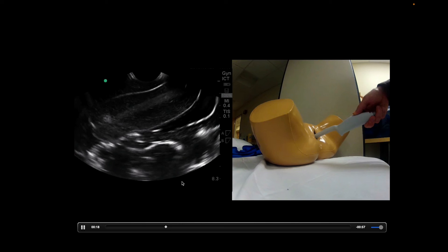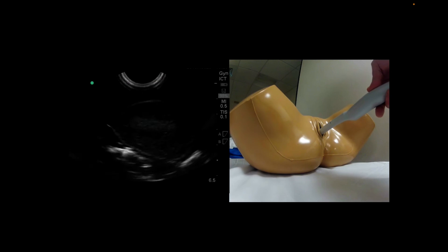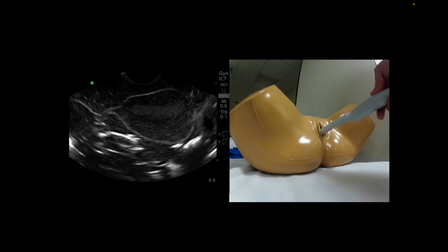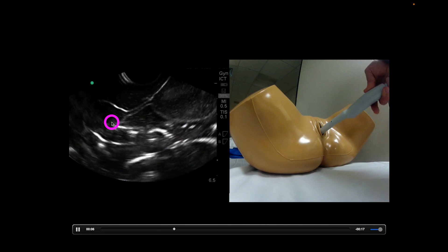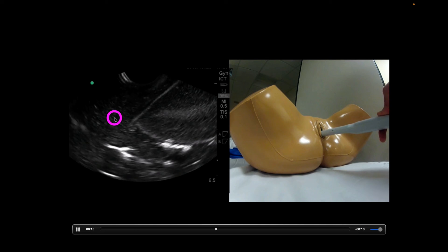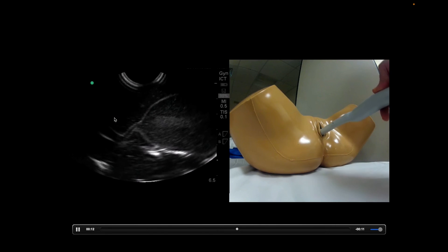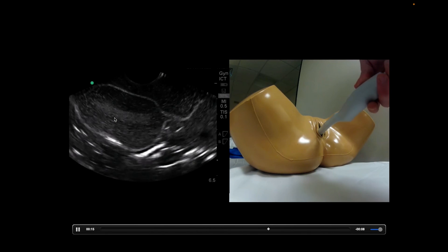Once you're done with the sagittal view, go ahead and change the transducer with the probe marker over towards the patient's right. Do the same thing — fan through making sure that you go left to right. We can see the adnexa over here, as well as up and down anterior and posterior, making sure to evaluate all of the structures that you can.